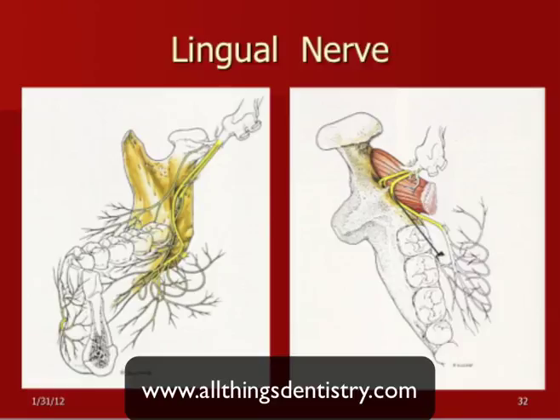Okay, we've gone through a lot of pre-ops and preparatory things here in order to start surgery, and they're very important that you do all those things, but you don't have to spend 45 minutes or an hour going through all those things. Once you get proficient, you should be able to go through the medical history, do your assessment, do your planning, make sure you have all the instruments there and plan your attack. And you ought to be able to do that in 15 or 10 minutes without any problem once you get proficient. But it is important you go through all those steps.